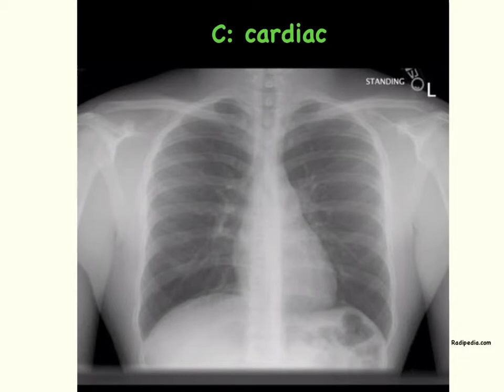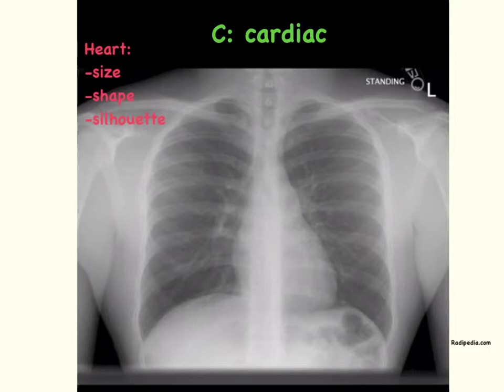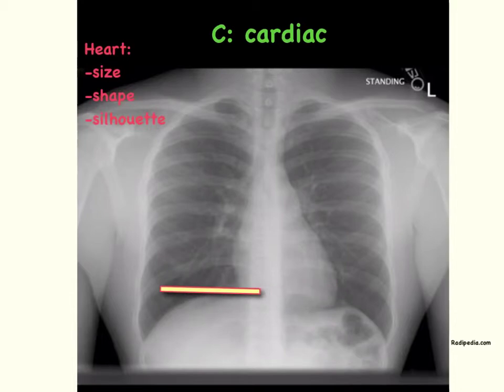C is for cardiac, so you're going to be evaluating the heart as well as other vascular structures. When evaluating the heart, you need to check the size, the shape, and the silhouette. When evaluating the size of the heart, you'll be looking specifically for cardiomegaly — you'll compare the diameter of the heart to the thoracic diameter. In adults and older children, the anterior cardiac diameter should be no more than 50% of the thoracic diameter. In neonates, the cardiac diameter is allowed to be 60% of the thoracic diameter. Here you can see this cardiac diameter is definitely less than half of the thoracic diameter.